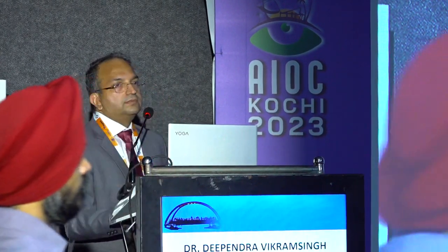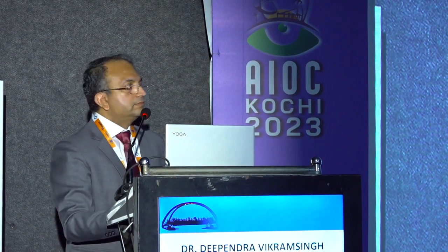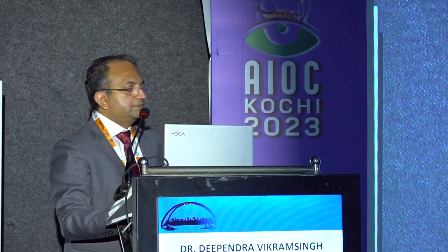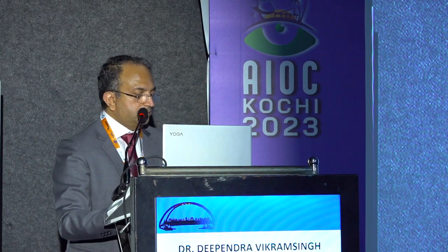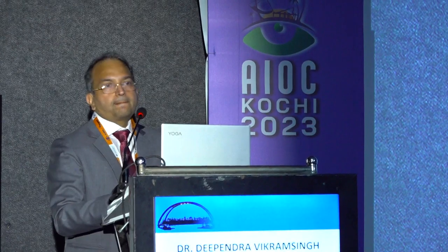You asked the question, how do you handle the nasal membranes in a left eye for a right-hand surgeon? You have to use bimanual surgery. You have to be ambidextrous in some way or the other. You can shift the microscope temporarily, like the cataract surgeons do. You can sit temporarily and approach it this way.